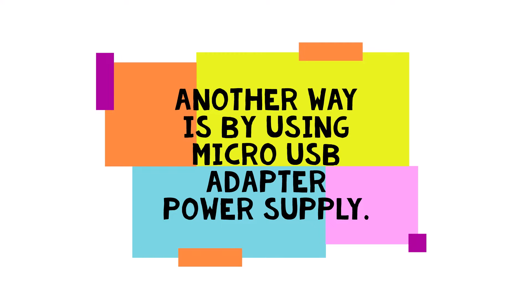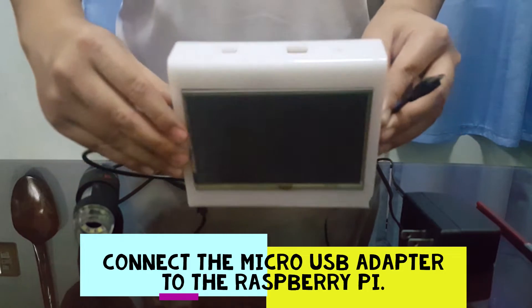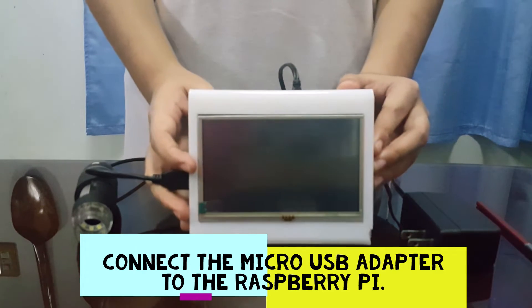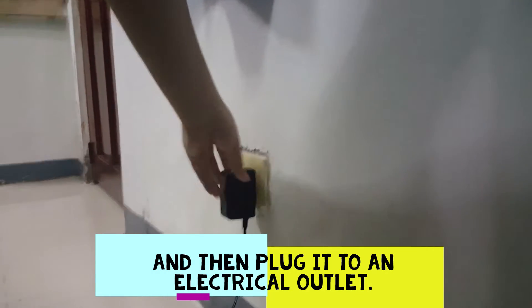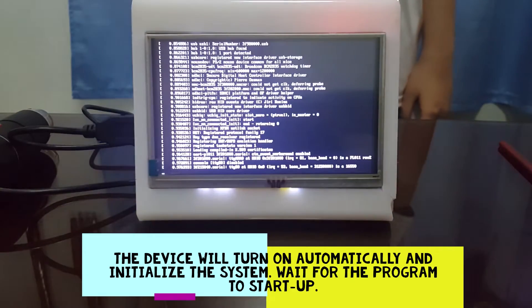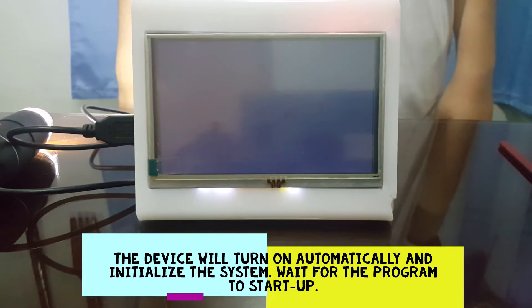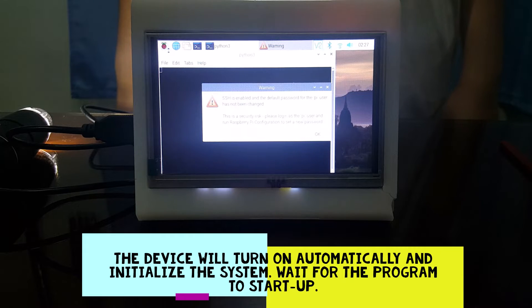Another way is by using a micro USB adapter power supply. Connect the micro USB adapter to the Raspberry Pi, and then plug it into an electrical outlet. The device will turn on automatically and initialize the system. Wait for the program to start up.